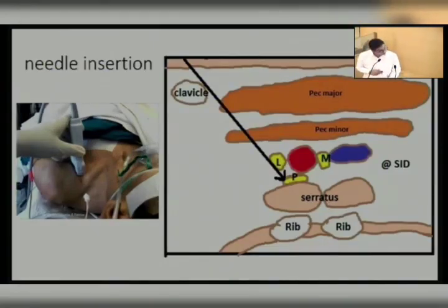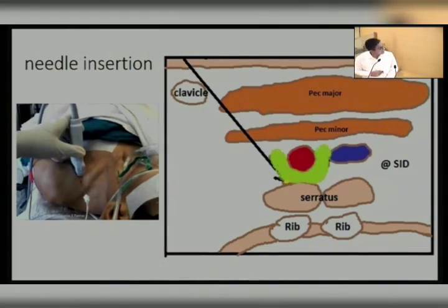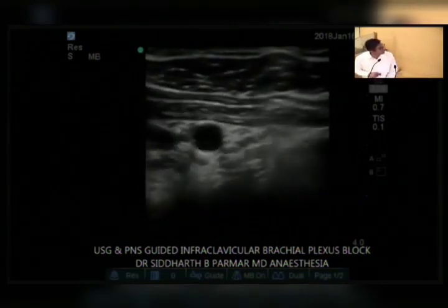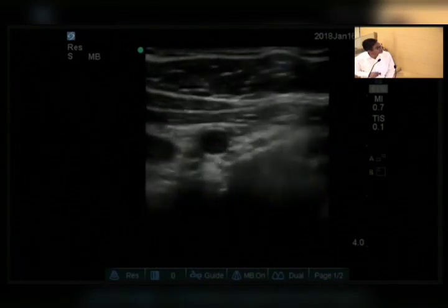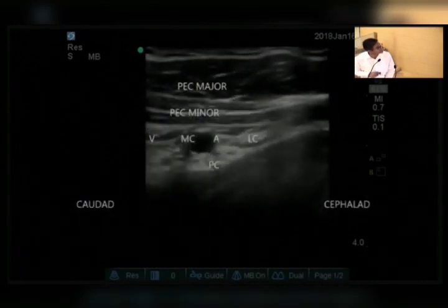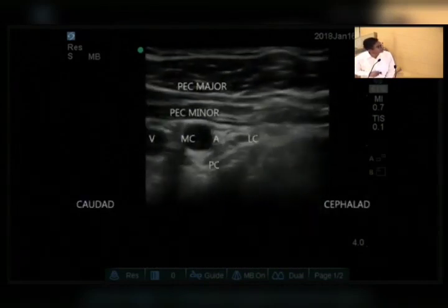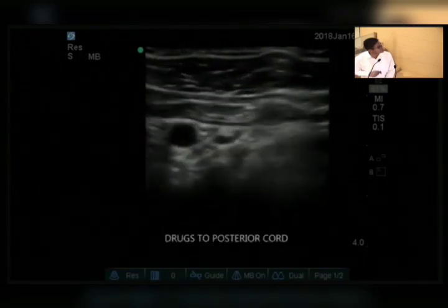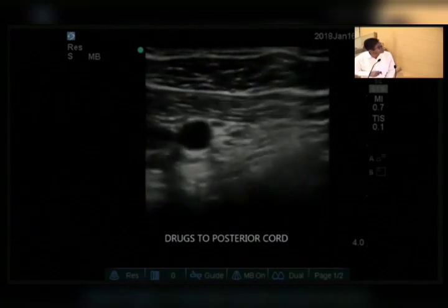See, the same thing over here, and we need to deposit the drug in a U-shaped manner. If the drug deposition is U-shaped, then the block will be successful. High chances are there. This is PNS and USG guided infraclavicular, in that the needle will come puncturing the pec major, pec minor, and reaching the posterior cord, and we will inject nearly about 15 ml of local anesthetic and try to see the local anesthetic spread, that is U-shaped.